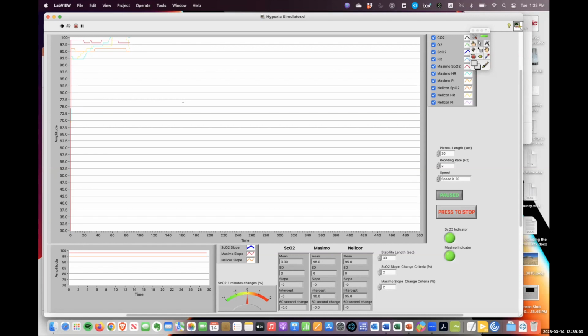I am a vigorous responder to hypoxia. It makes me a safer breath hold diver, but not as good in some ways. So if people get sleepy, they're low response, I tend to have the CO2 go up a little bit more. If people are really short of breath, you can modify it and make the study much more comfortable. We also use a rebreathing system, which means if someone decides to take a deep sigh, the FiO2 is automatically going down. Even a computer-controlled system would not be able to respond to that. So it helps stabilize the plateau.